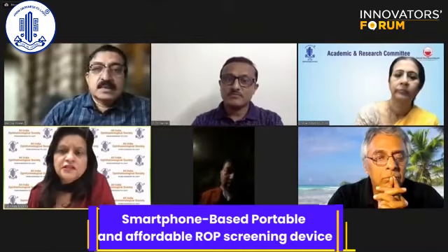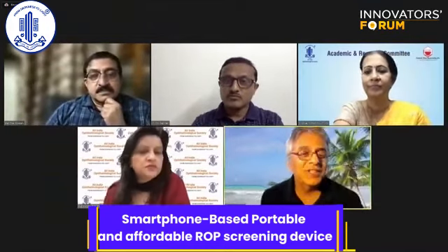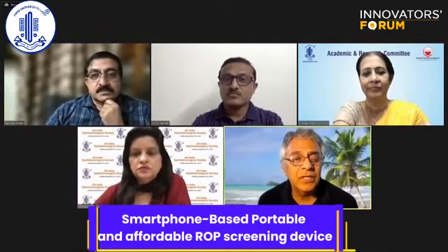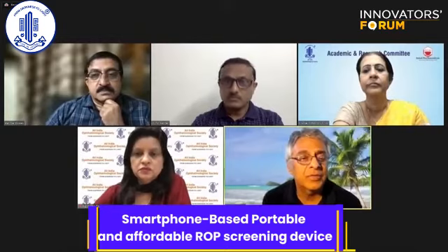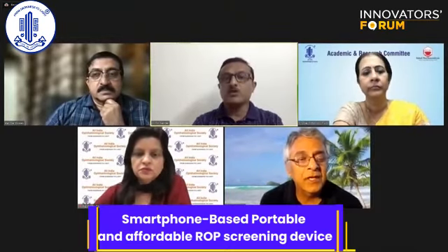Dr. Lalit sir, Dr. Partha. Yeah, excellent, Alay, as usual, a lot of innovation you keep doing. How is it vastly different from Dr. Ashish Sharma's device from Coimbatore? He has a more or less similar one. MI RETCAM. Yeah, MI RETCAM, yeah.